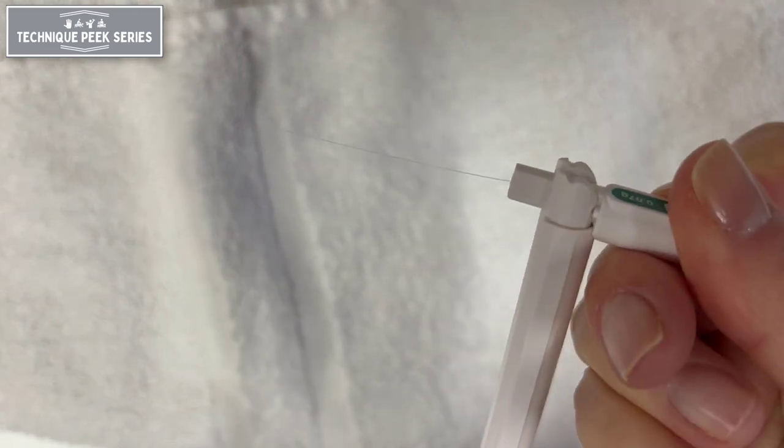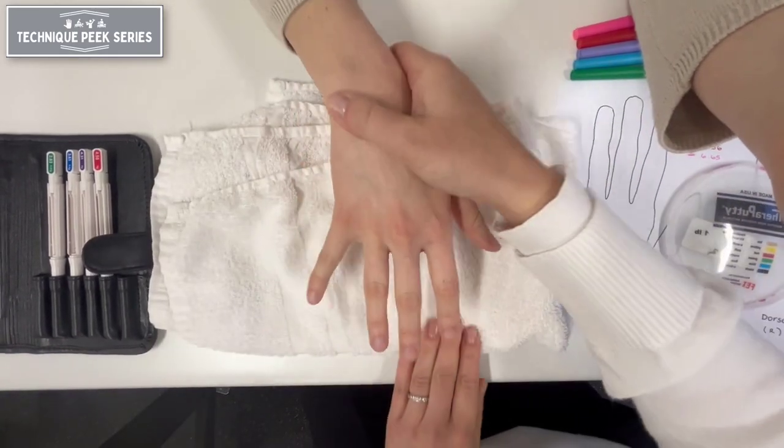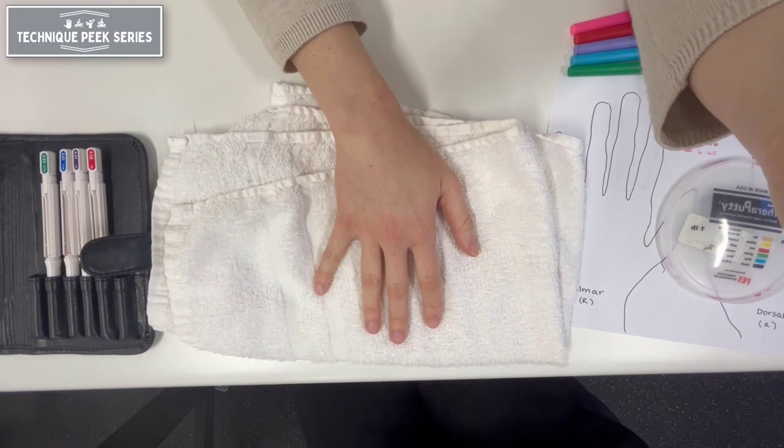To begin, rest the patient's extremity on a stable padded surface. Testing should be done in a quiet area to help the patient fully attend to the testing procedure. Next, occlude the patient's vision.